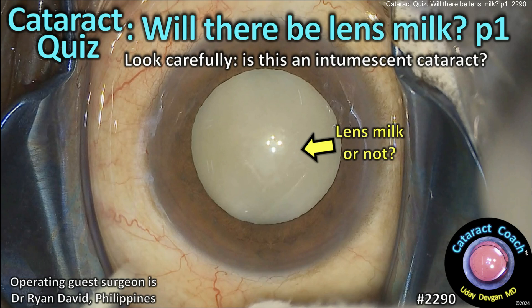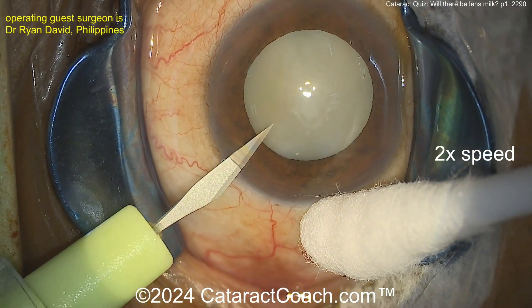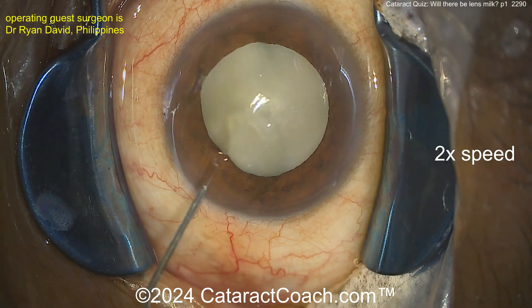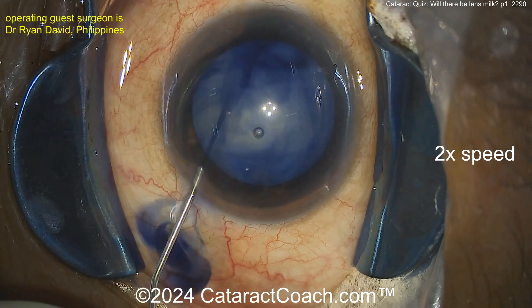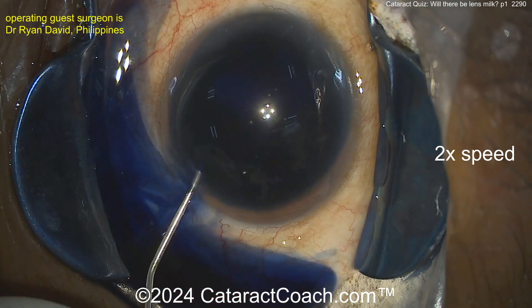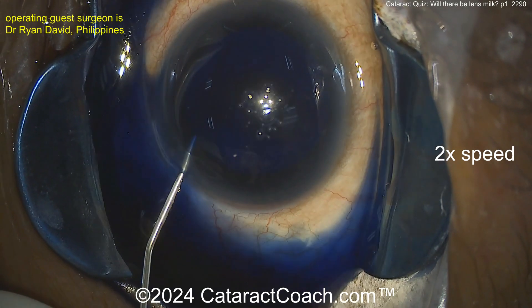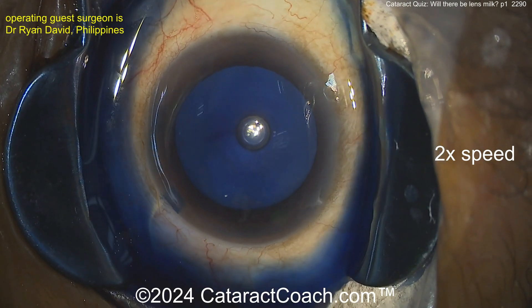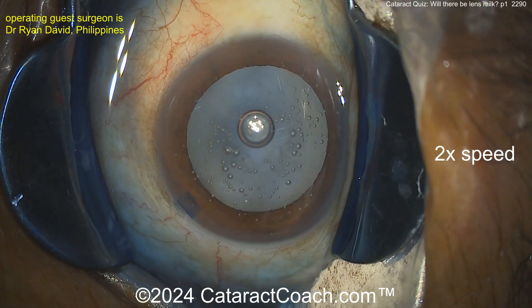CataractCoach.com cataract quiz - will there be lens milk? Part one. Look carefully: is this an intumescent cataract? Can you predict will there be lens milk, or in other words liquefied lens cortex coming out of the capsule bag? It's kind of a uniform whitish color, not that pearlescent. Here's some trypan blue dye going in. The question is: do you think this has a big risk for Argentine flag sign?